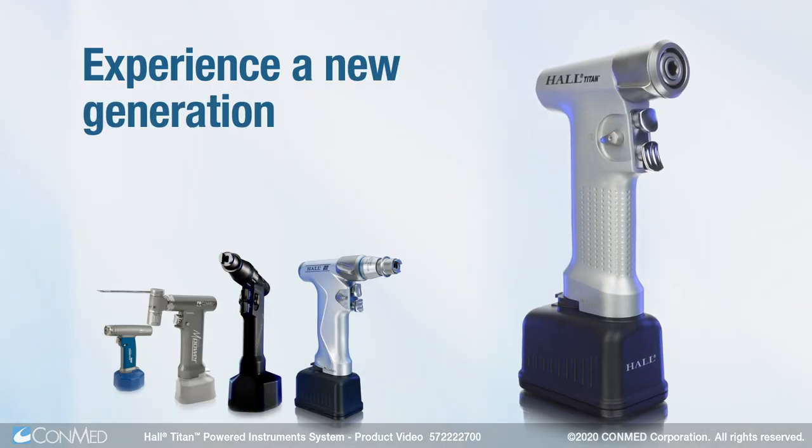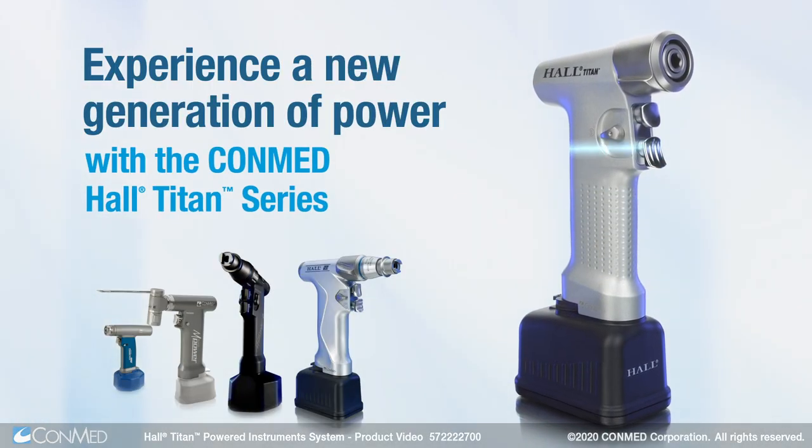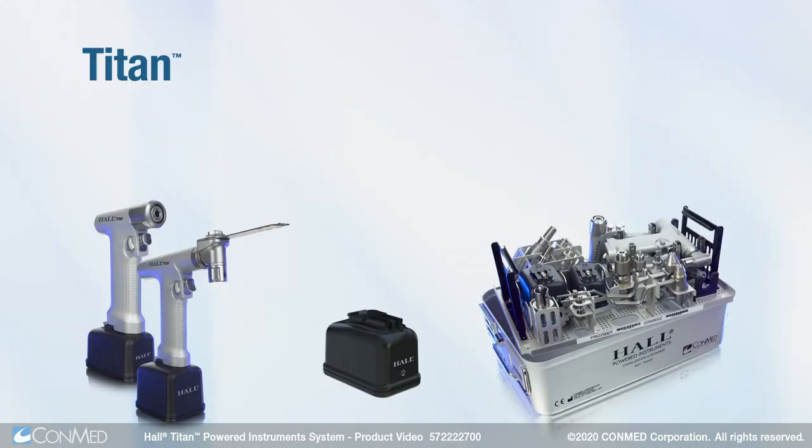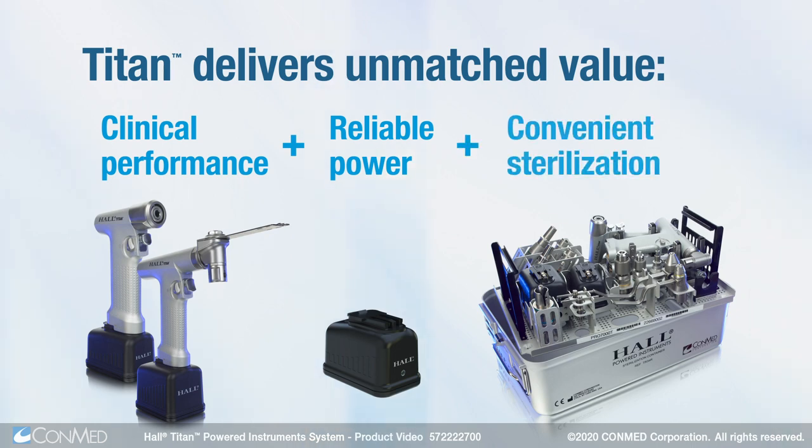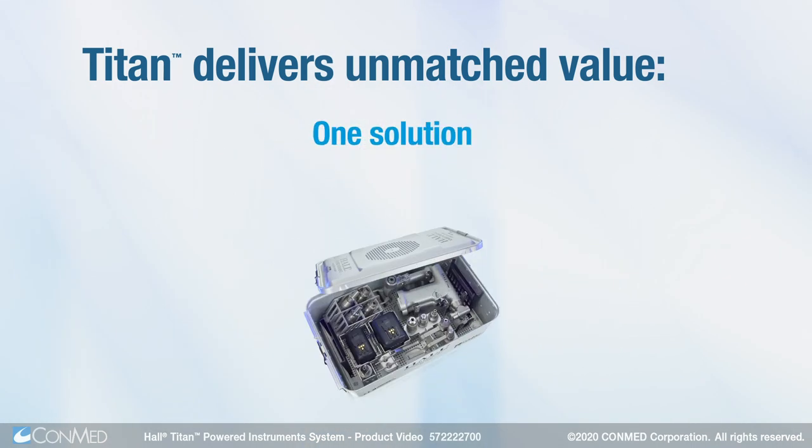Experience a new generation of power with the ConMed Hall Titan Series. Titan delivers unmatched value, combining clinical performance, reliable power, and convenient sterilization into one solution.